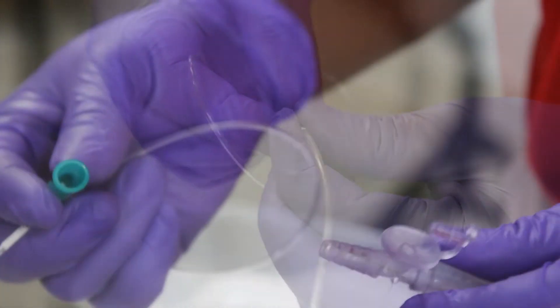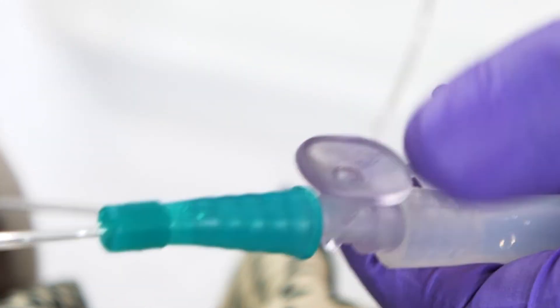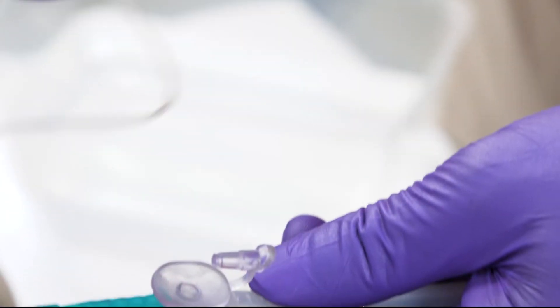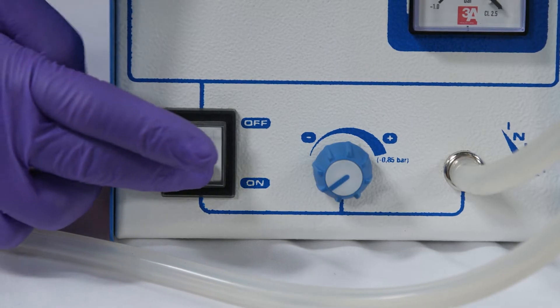Attach the catheter to the connector and turn on the machine, making sure the hole is open. While the hole is open, the machine is not yet suctioning through the catheter. You close the hole to start suctioning. Switch on the machine.